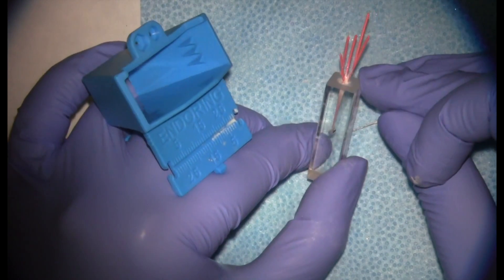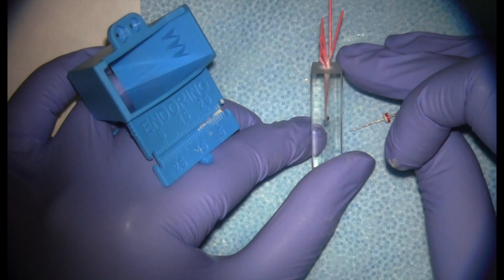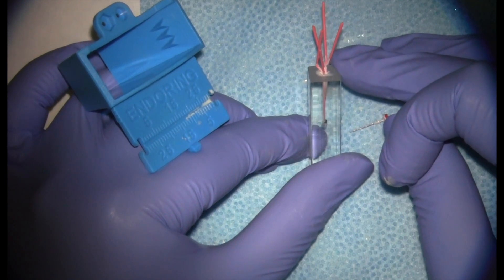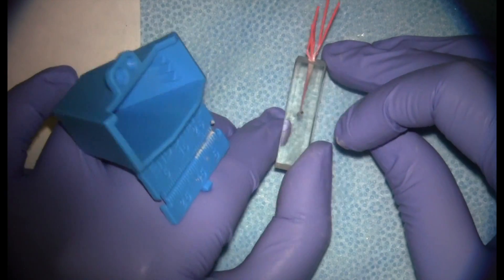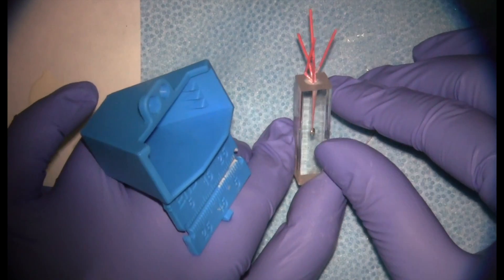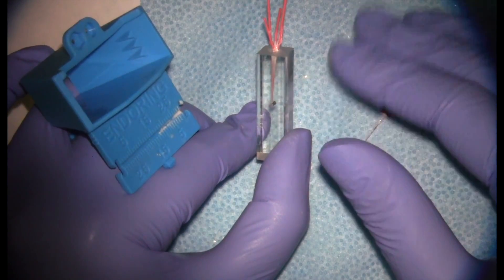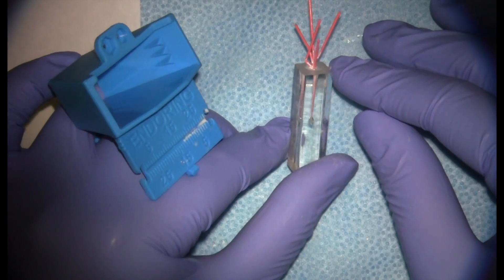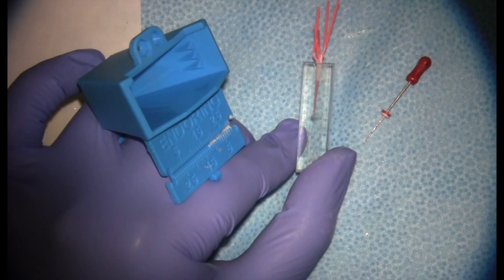At this point, if we're happy with the depth of our spreader penetration and the number of accessory points, clinically or on our extracted mounted teeth we're going to take the pre-sear shot. On that radiograph we're looking for our obturation to reach our corrected working length and for adequate density of obturation — the filling should look like it's filling the canal space with no voids or spaces between the gutta-percha. If that all looks good, we'd be ready to do our sear-off.